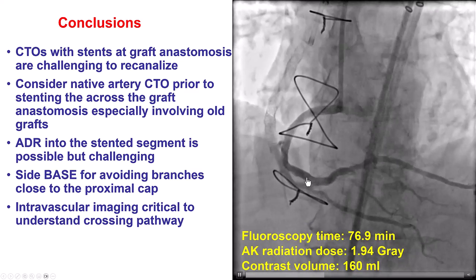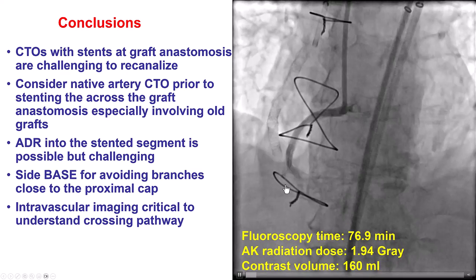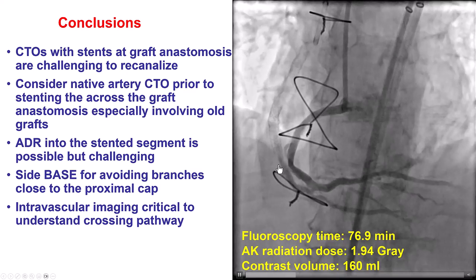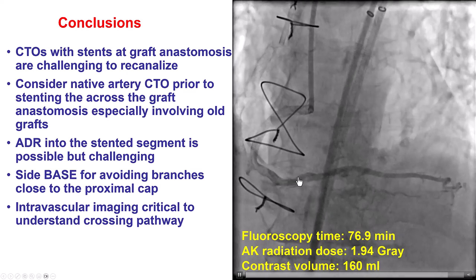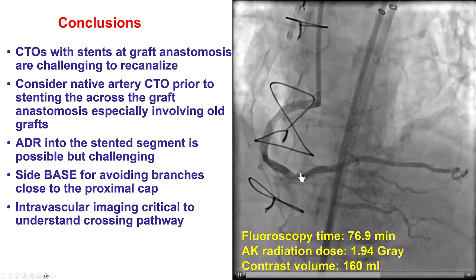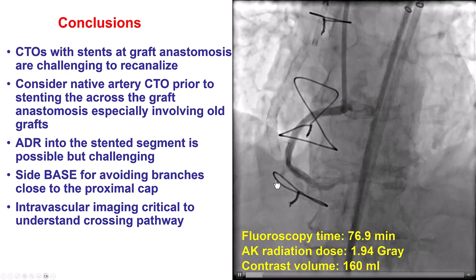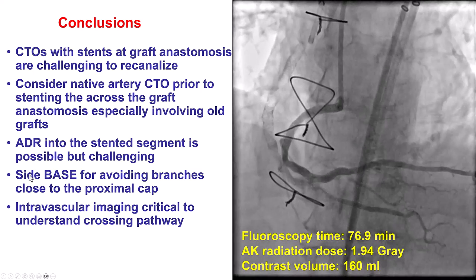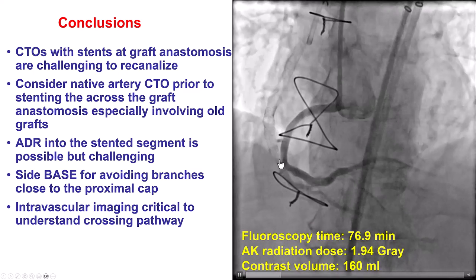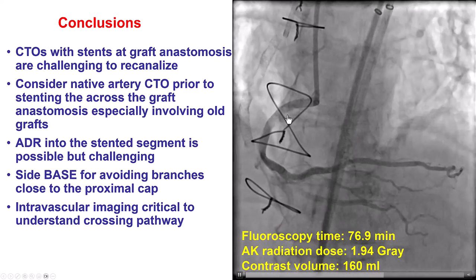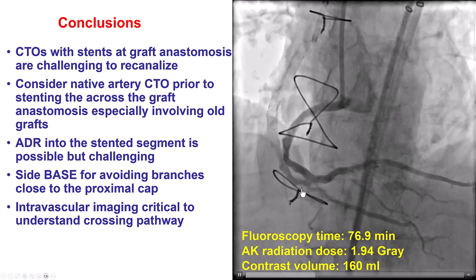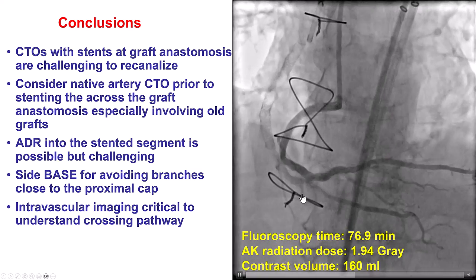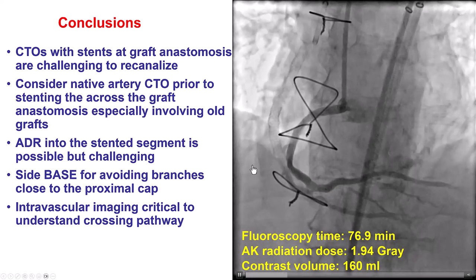In this case we thought we did ADR, but in the end what we had actually done was puncture through the previous stent. What was critical to success is unclear, but potentially the shockwave balloon dilatation, the use of stiff wires, and various microcatheters was likely what led to success. Also, to advance an extra-plaque wire, we required the side-branch balloon technique — very useful when there is a side branch at the proximal cap. And finally, IVUS was critical here to understand that we had actually crossed through the stent, ensure good stent expansion, and help optimize the angiographic result.